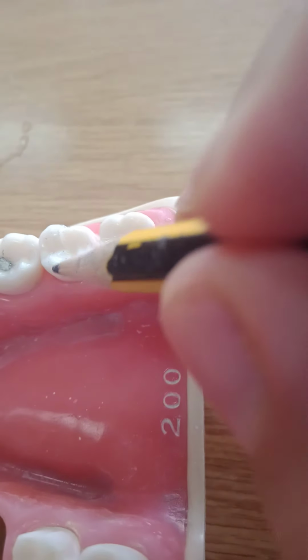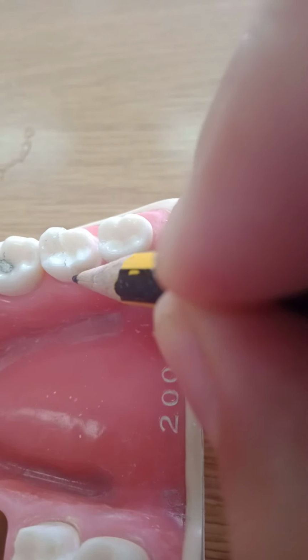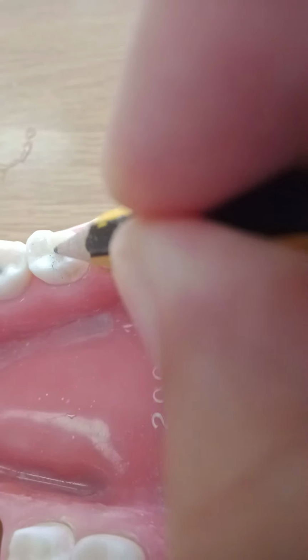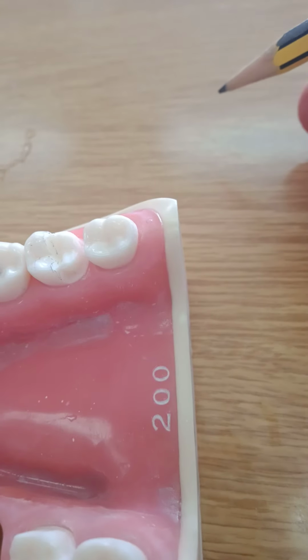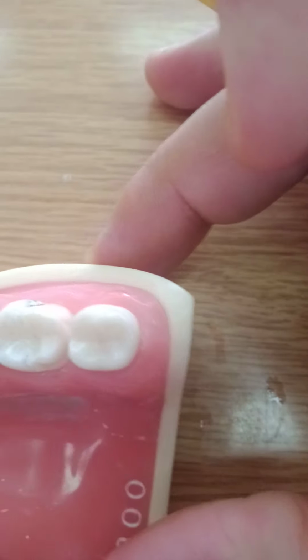I prefer that you continue with the preparation, bypass the half of the tooth and put your groove here, and then join the two grooves by a slot or by a groove going over the occlusal surface. Chamfer-wise, the chamfer is clear.